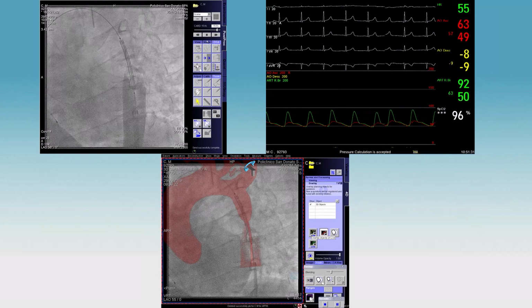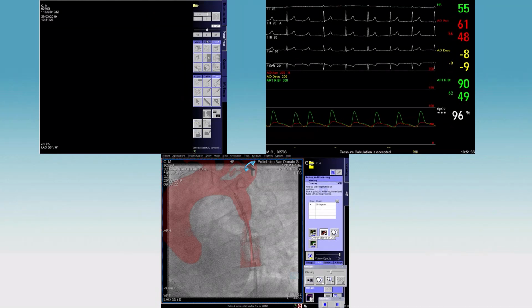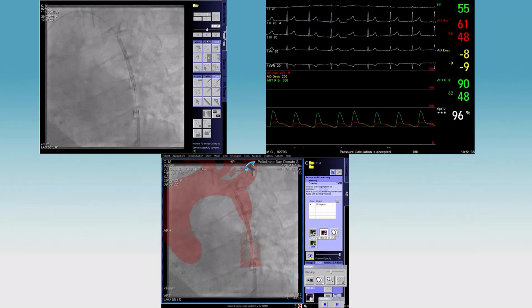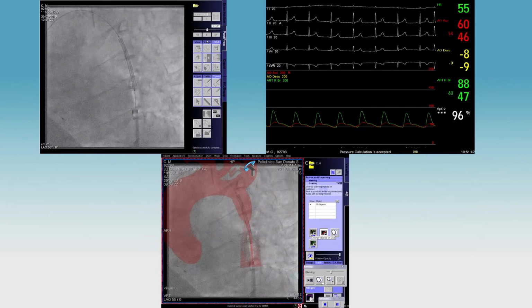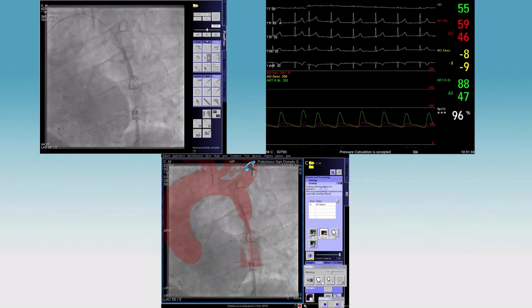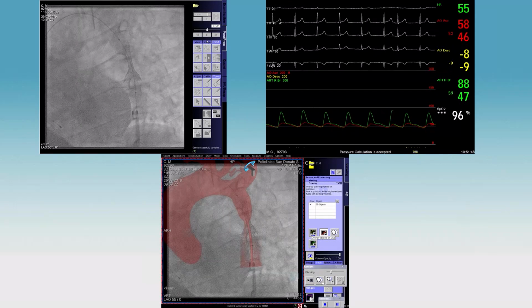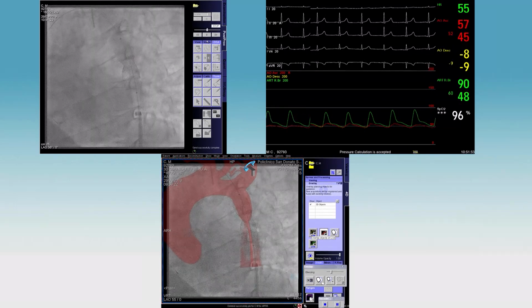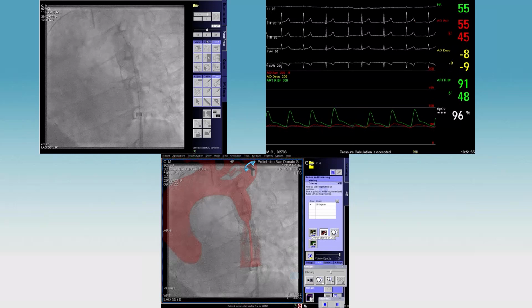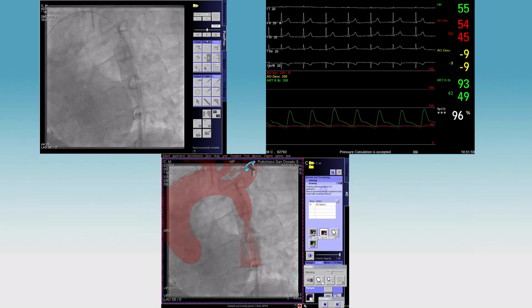So you do that, and I'll do this. So we're going to do the volume. Yeah, go ahead. Just go slowly. So we're just inflating the balloon by hand first, very slowly, and then I'll do the indeflator after that. You can see how it shortens, can't you? So if you turn towards me, yeah.